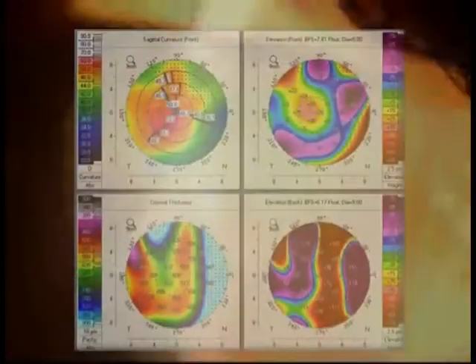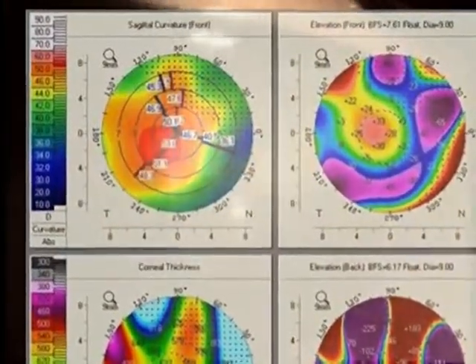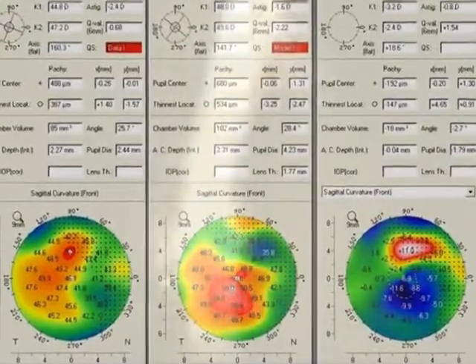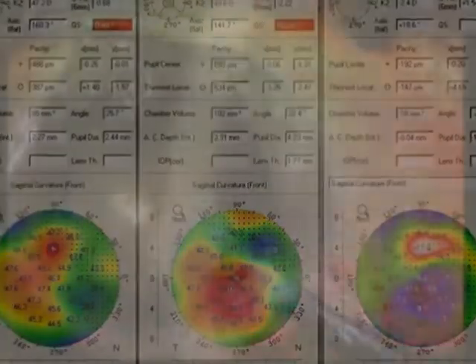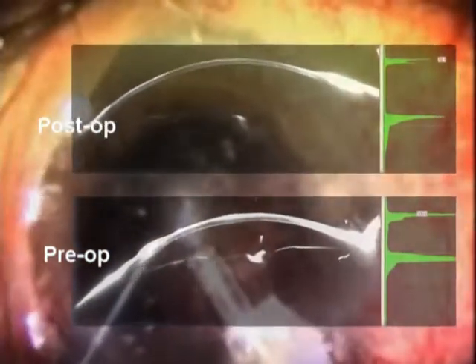of age-related macular degeneration. Based on the patient's tomographic findings, we proceeded with a combination of therapeutic PTK and TCAT PRK with mitomycin C. 2 weeks later, cataract surgery with intraocular lens implantation was performed. The postoperative anatomical corneal outcome was excellent, but the overall vision was limited by an AMD scar.